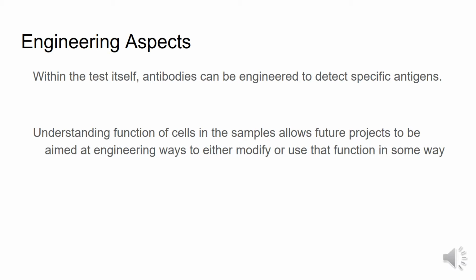There are a few engineering aspects that are related to histological techniques. With the high specificity of antibodies for their target antigen, successful stains can sometimes be a challenge to generate. Sometimes other antibodies that are specific for the desired target antigen are also hard to find in nature. For those reasons, engineering antibodies to detect the exact antigen that's intended to be tested is a good way of amplifying the technique's functions.